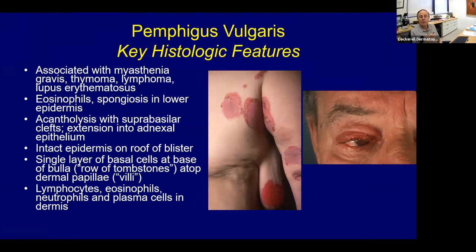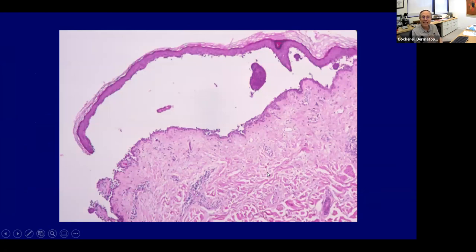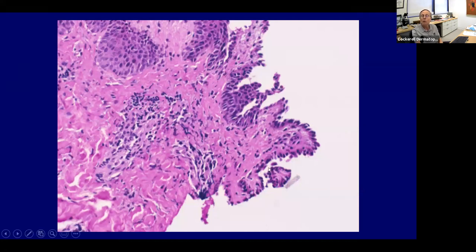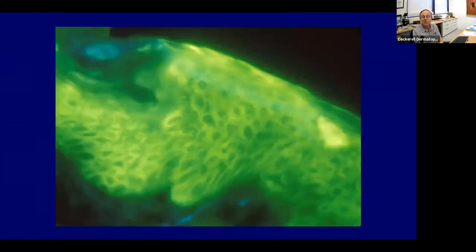Pemphigus vulgaris is associated with myasthenia gravis, thymoma, certain lymphomas, and is often seen in Ashkenazi Jewish men. It's an intraepidermal acantholytic process, with acantholysis just above the basal cell layer. It extends down into hair follicles, often involves mucous membranes and conjunctiva, and the perianal area is a very common site. Classic histology shows the row of tombstones with acantholytic cells floating freely in the blister space — no viral cytopathic effect. Immunofluorescence shows chicken-wire intercellular binding of IgG and C3.